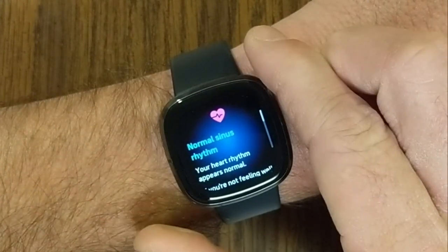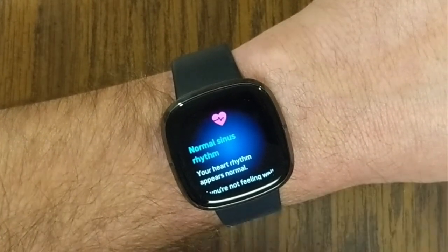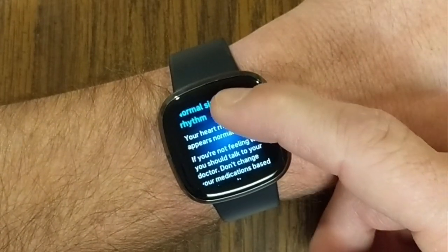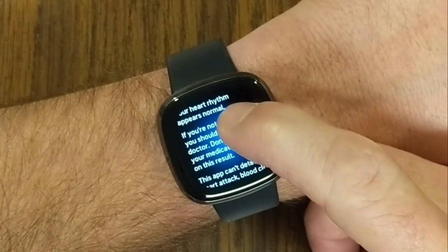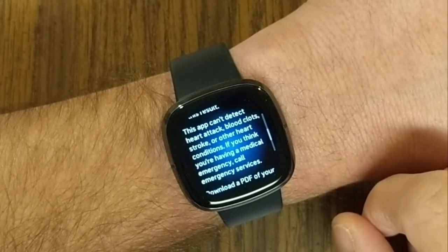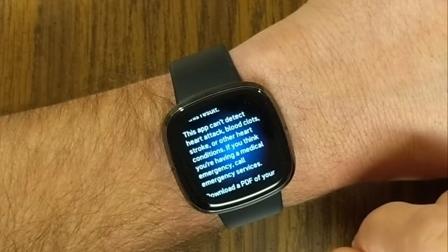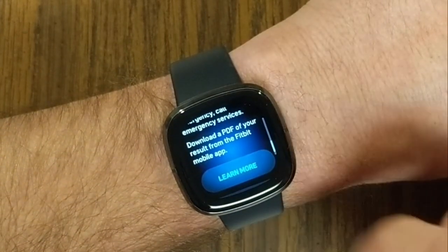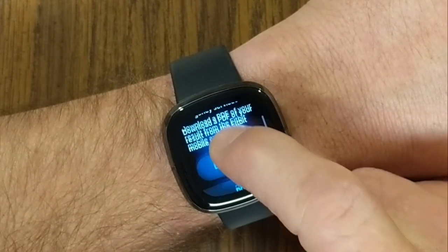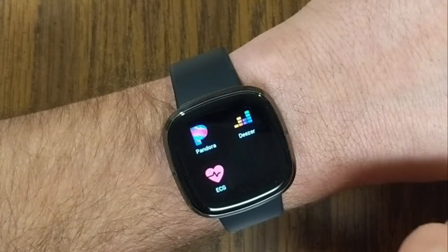It's going to analyze that data, and it is saying that I have normal sinus rhythm — well, that's a relief. My heart rhythm appears normal. If you're not feeling well, you should talk to your doctor. Don't change your medications based on this result. This app can't detect heart attack, blood clots, stroke, or other heart conditions. If you think you're having a medical emergency, call emergency services. It says here: download a PDF of your result from the Fitbit mobile app. I'm just going to hit done, and that takes me back to the menu on the watch.